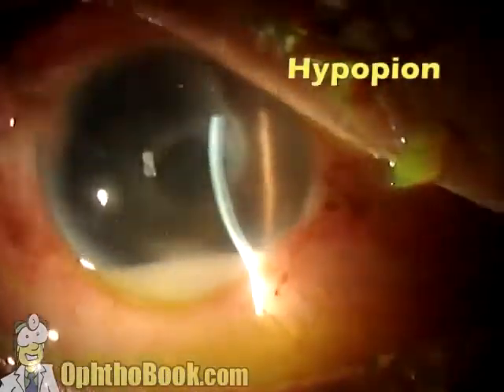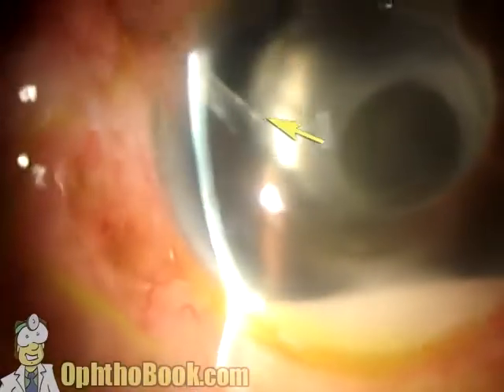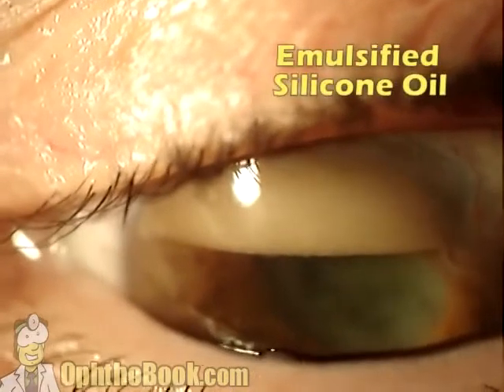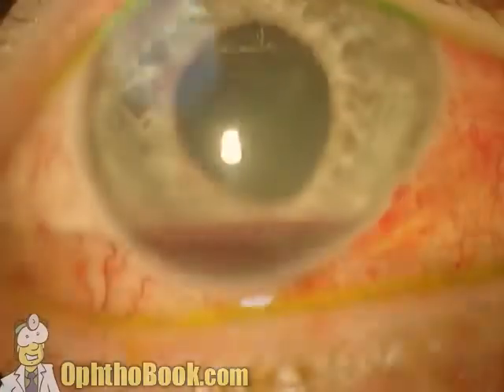You get enough inflammatory cells, they'll settle to the bottom, form that hypopyon we looked at before. They can be sterile or infectious. This is probably from an infection from this tube shunt that went bad. This is emulsified silicone oil. After a retinal detachment surgery, that silicone burped into the front part of the eye, and silicone's lighter than water. It floated to the top and created almost an inverse hypopyon.